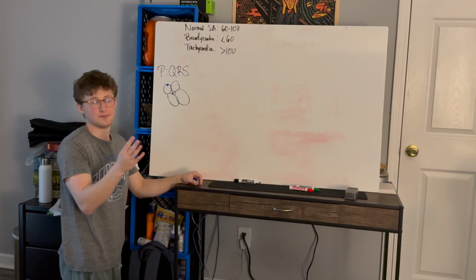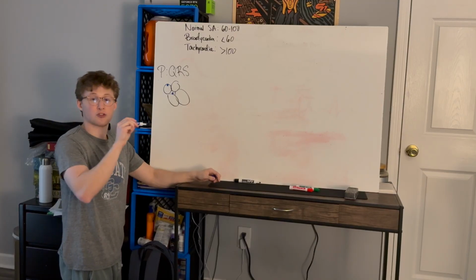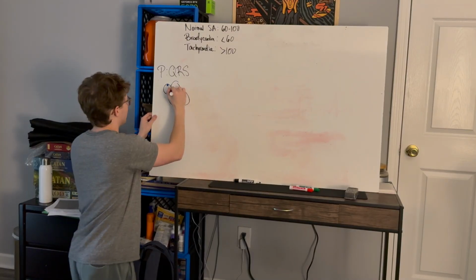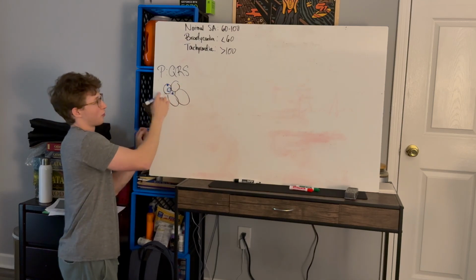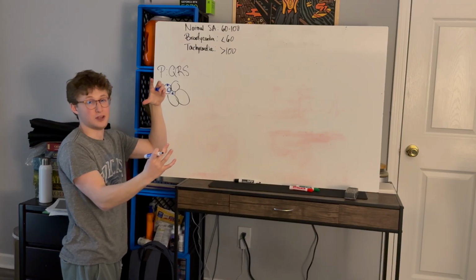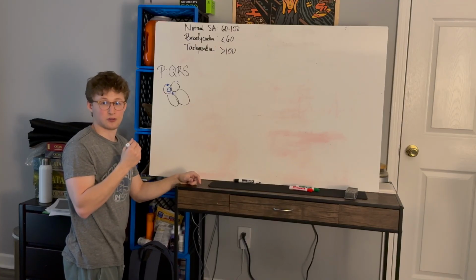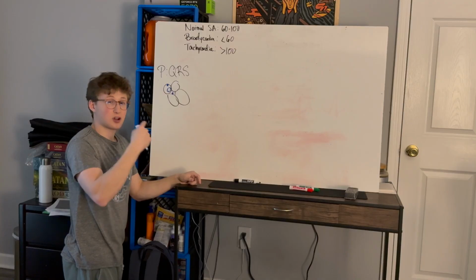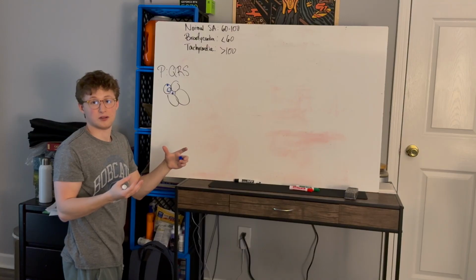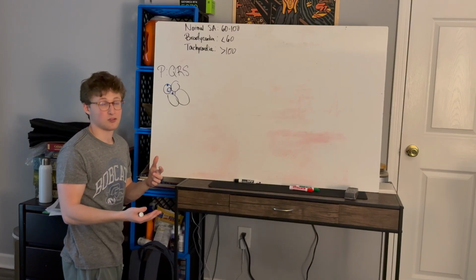So 5 to 1. A better example is atrial flutter. It is a re-entry circuit of electricity in the atria that's going like this, and it's going circular, and every time it circles around, it's depolarizing the atria and depolarizing towards the AV node. But the AV node can only send so many signals down to the ventricles. If the signals come to the AV node too quickly, it is in a refractory period. It's resetting from the last impulse, and it can't take another one, so it blocks it.